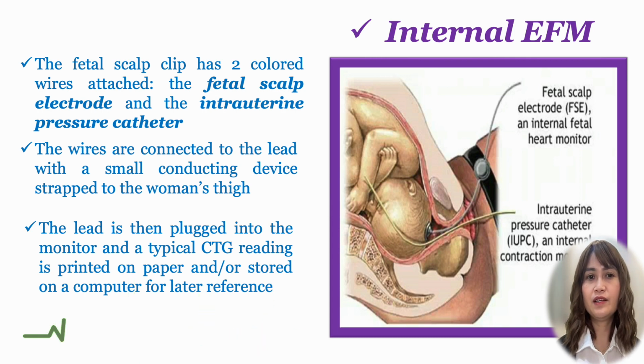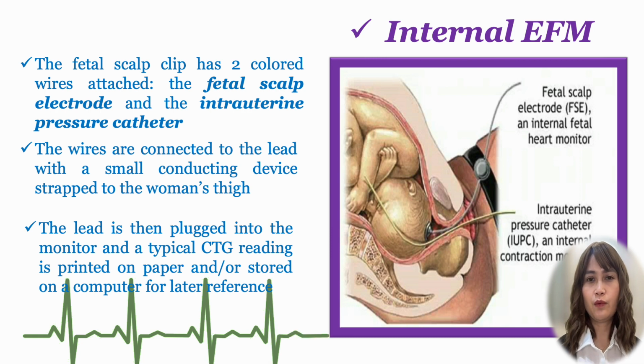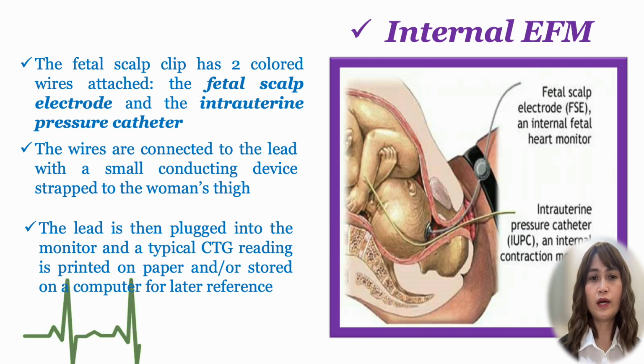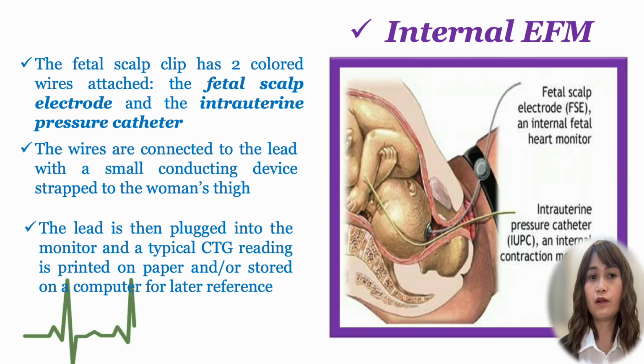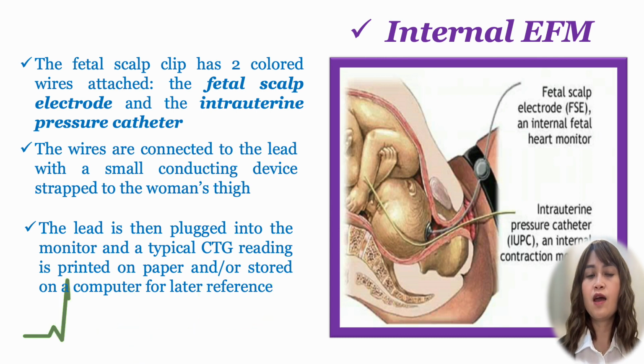Also, internal measurement requires a certain degree of cervical dilatation, and the waters need to be broken to attach the fetal scalp electrode to the baby's head. If they are not already broken, this will need to be done to allow the electrode to be attached. And women who carry the herpes, hepatitis B or C, or HIV viruses are recommended not to have internal monitoring because it can increase the baby's chances of becoming infected with these viruses.